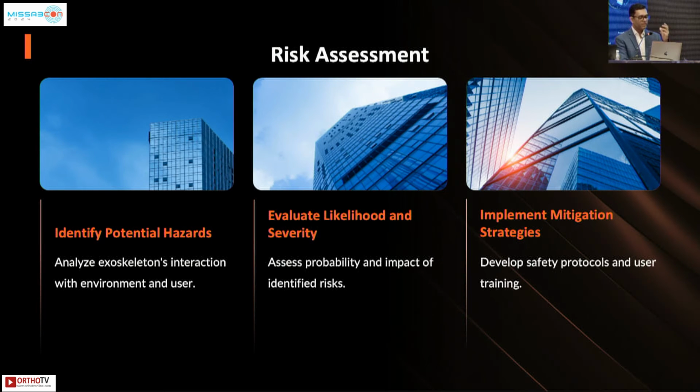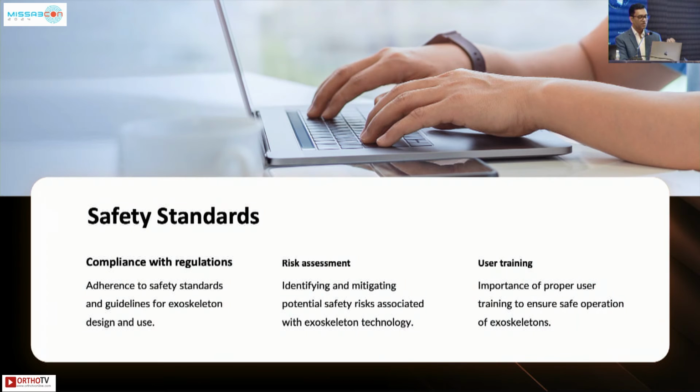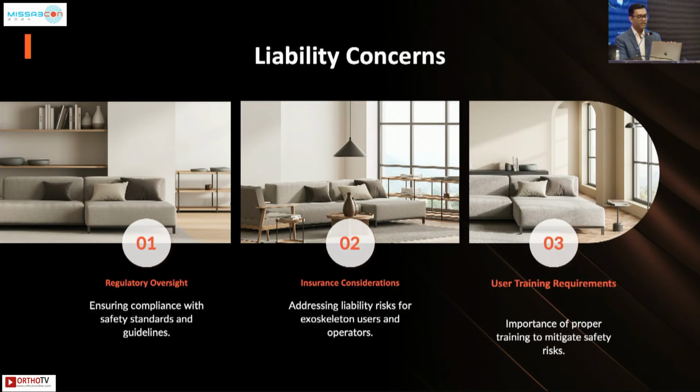So you have to identify potential hazards. You look at the likelihood and severity, mitigation, various strategies. We have to have compliance. We have to look at risk assessment, where this patient is going to use it. Is it at home? Is it for mobility? Is it for work? And what is the training that he's going to undergo?